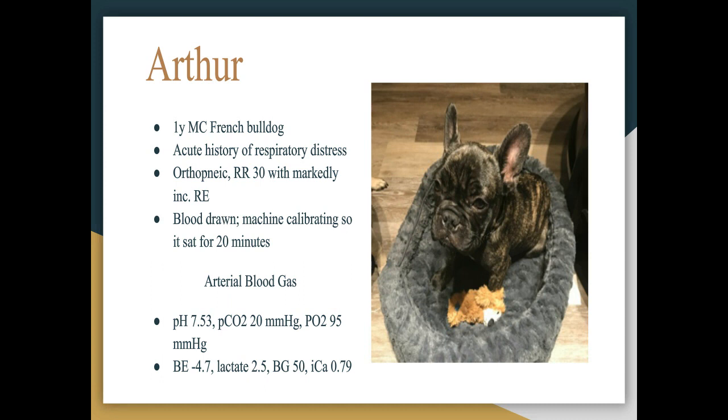My main concern for the oxygenation and ventilation status for this patient is that the tube was probably not capped, and this would have artifactually increased the PO2, artifactually decreased the CO2, and because of the decrease in the CO2, increased the pH, making the sample alkalemic. This alkalemia would have also caused the decreased ionized calcium.